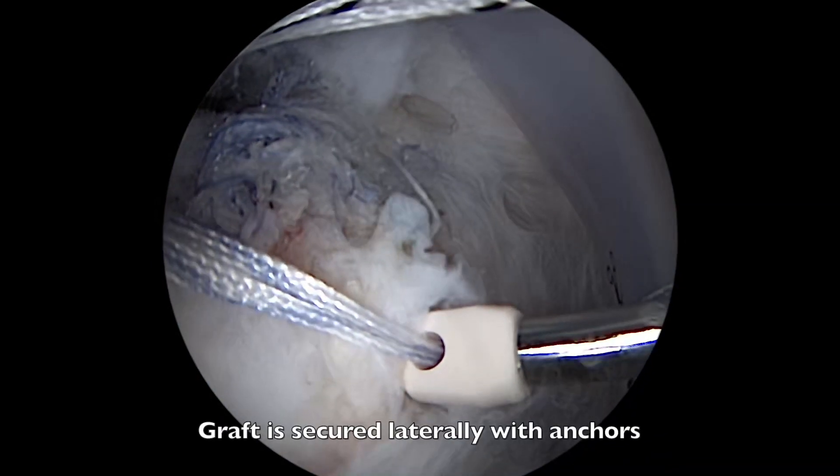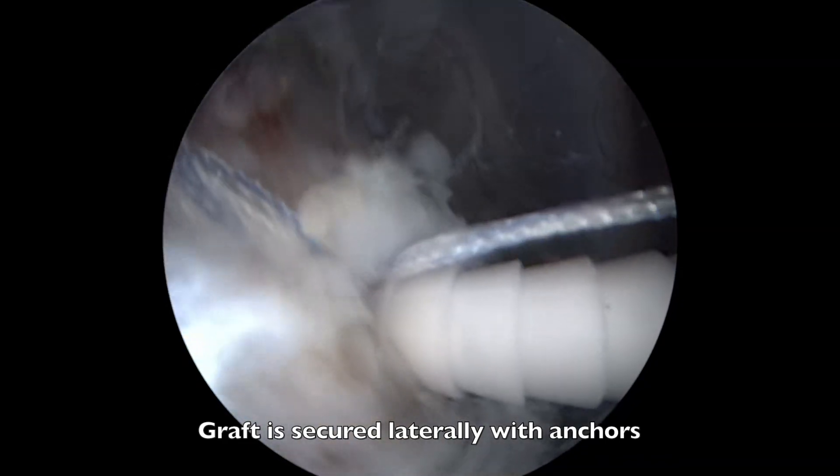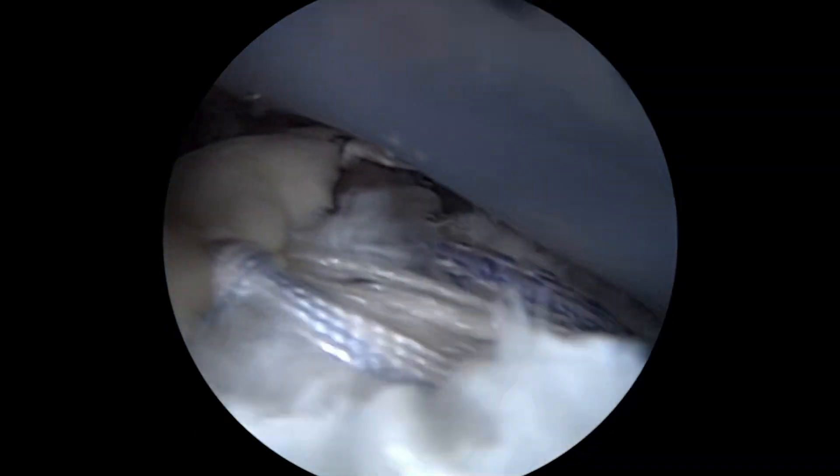The lateral sutures of the graft can now be secured to the tuberosity on the humerus to secure the graft laterally. It is important here not to over-tension the graft.